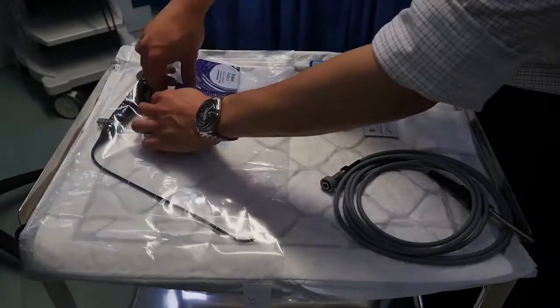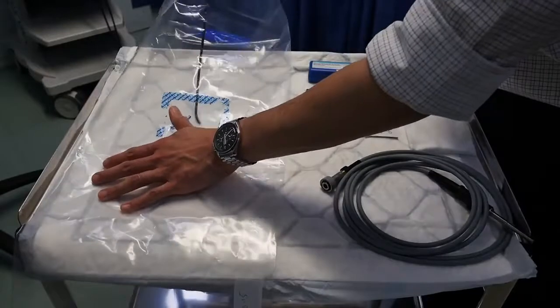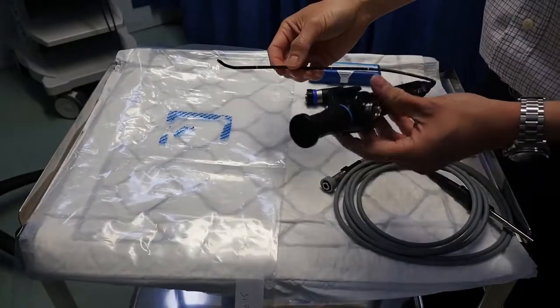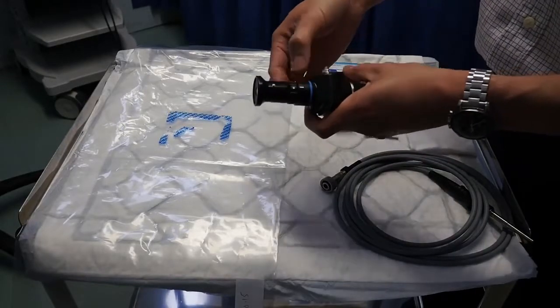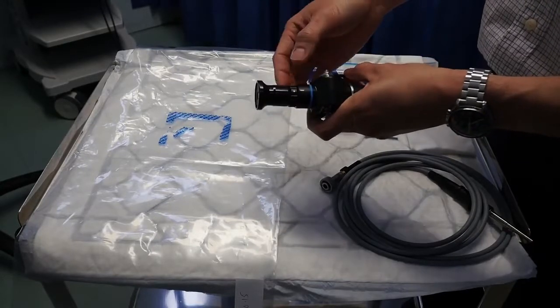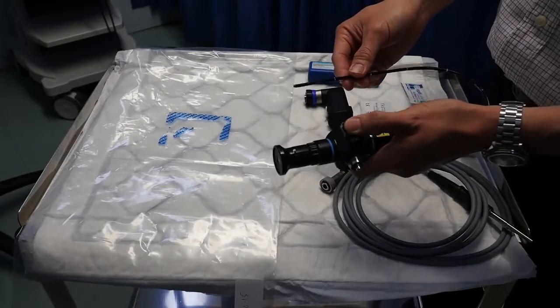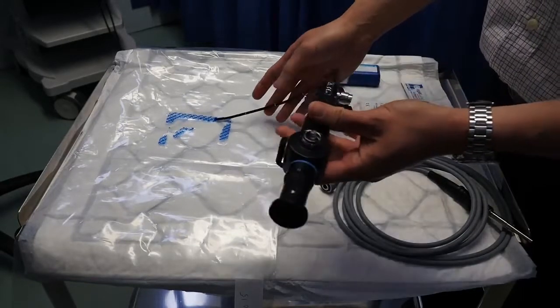Okay, the next step is now we're going to put the scope together. So we're just going to take it out of the sterile bag. Essentially, these are the parts of the scope. That's the viewing piece. You've got a little bit here to focus the scope. Most of the time it's already in focus. And you've got a little pivot here to move the scope end up and down. And this is the light attachment, all right?